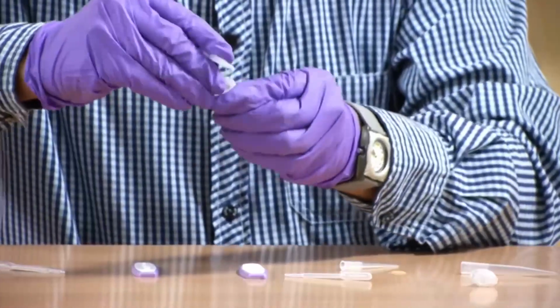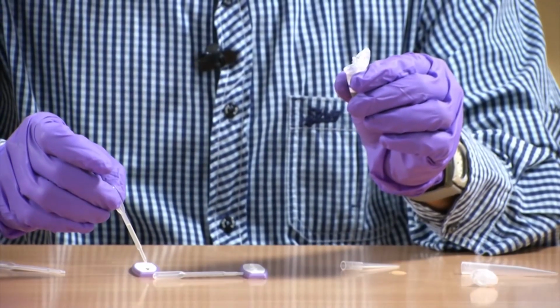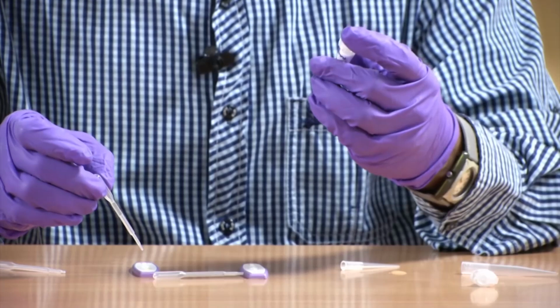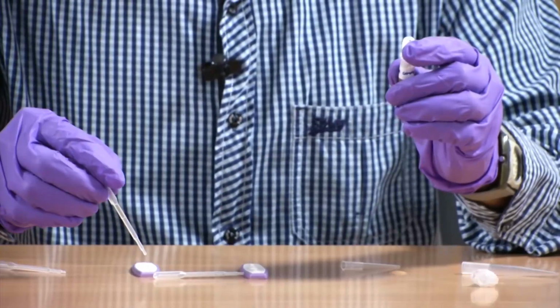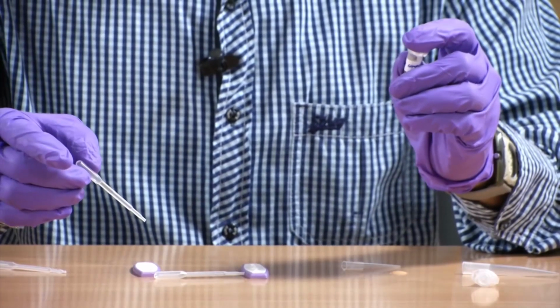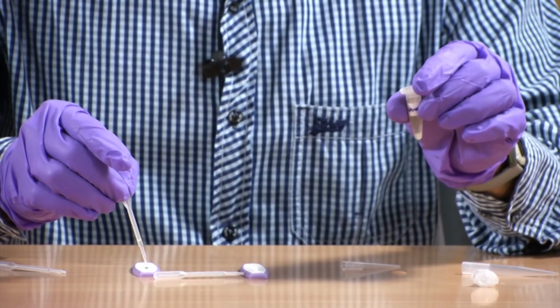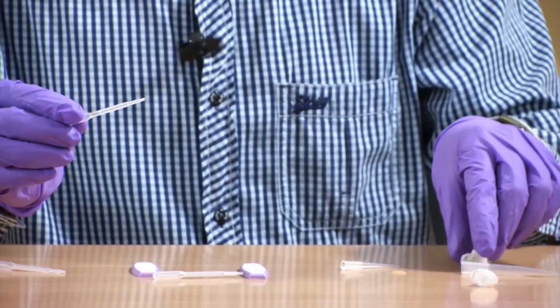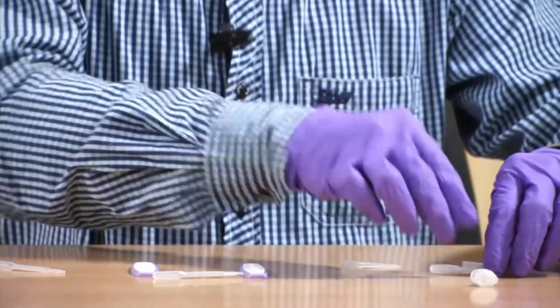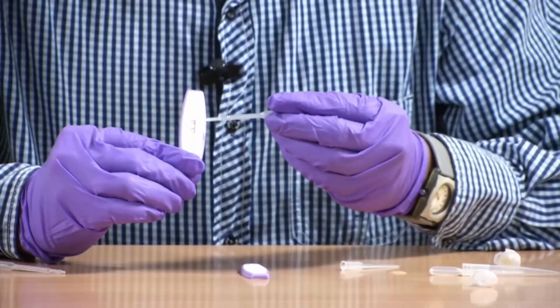In the other kit I will add the urine sample. In the kit where I added the urine sample, you will be able to see 2 lines, one for the test line and another for the control. If we have 2 lines, that means the particular person is pregnant. You can see here you are able to see 2 lines, right. One is for the control and one is for the test line.